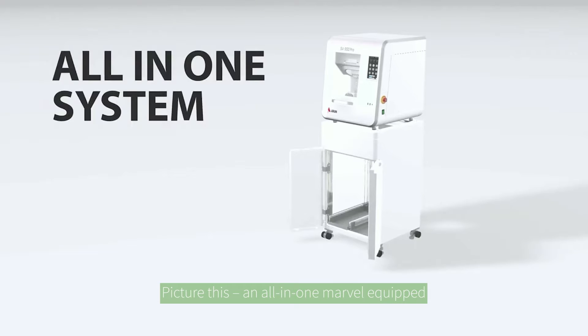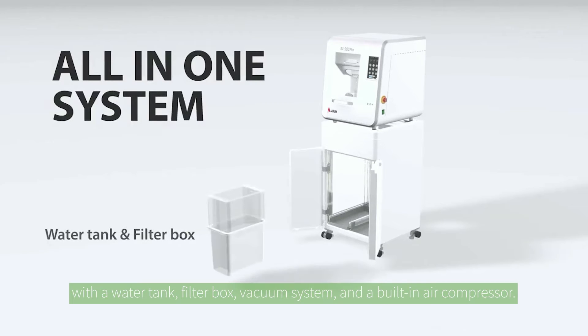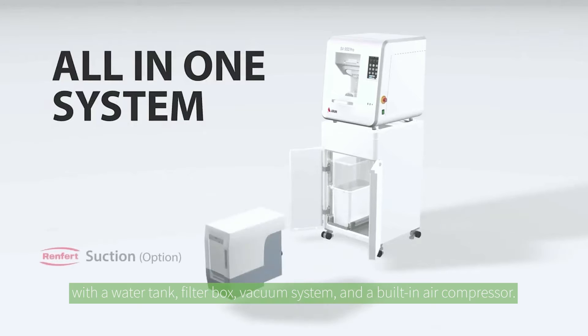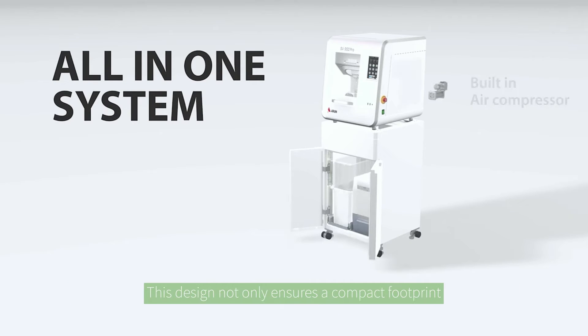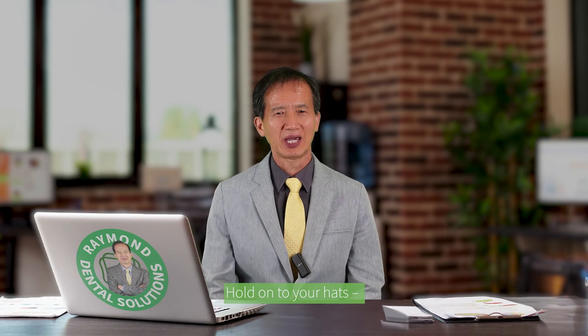Picture this: an all-in-one machine equipped with a water tank, filter box, vacuum system, and built-in air compressor. This design not only ensures a compact footprint, but guarantees whisper-quiet operation too.